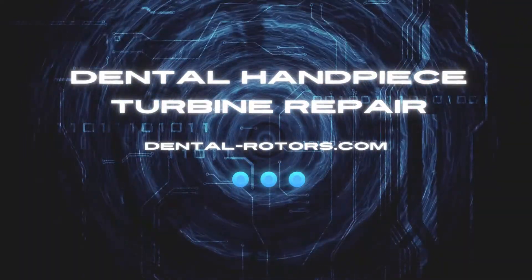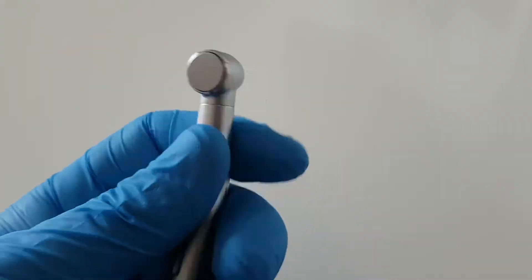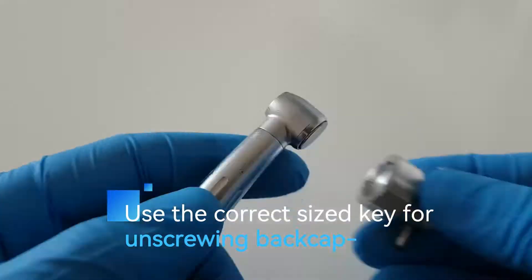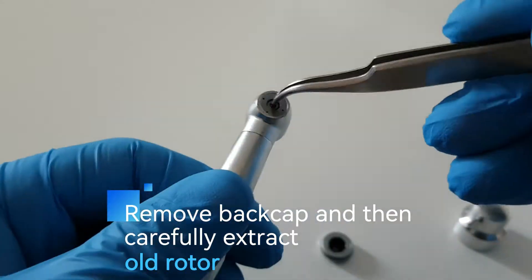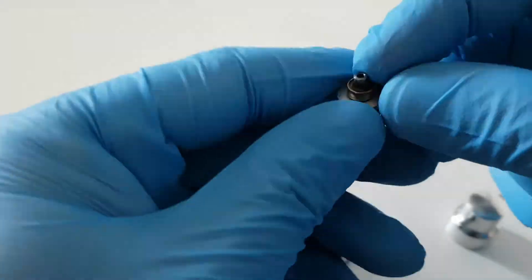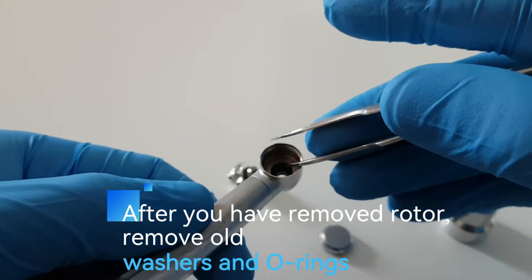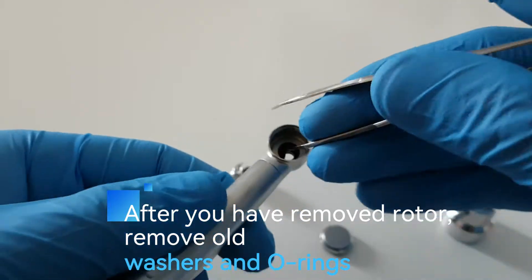Dental handpiece turbine repair. Use the correct sized key for unscrewing the back cap. Remove the back cap and then carefully extract the old rotor. After you have removed the rotor, remove the old washers and o-rings.